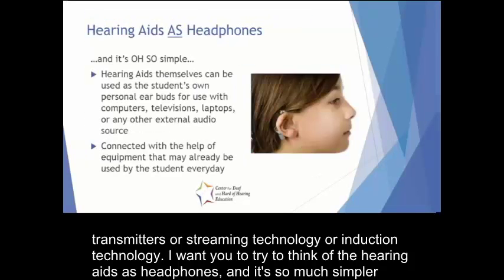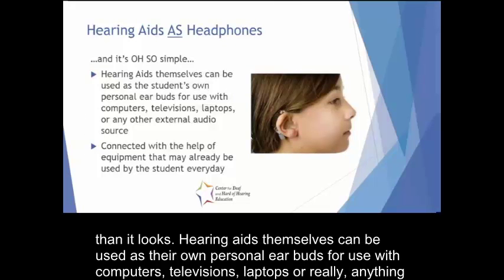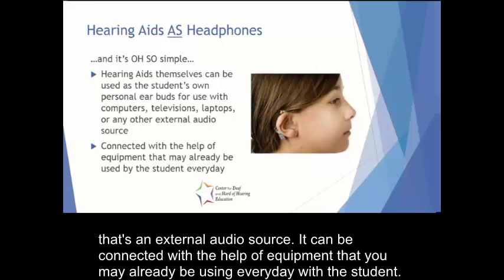technology. I want you to try to think of the hearing aids as headphones, and it's so much simpler than it looks. Hearing aids themselves can be used as their own personal earbuds for use with computers, televisions, laptops, or really anything that's an external audio source. It can be connected with the help of equipment that you may already be using every day with the student.